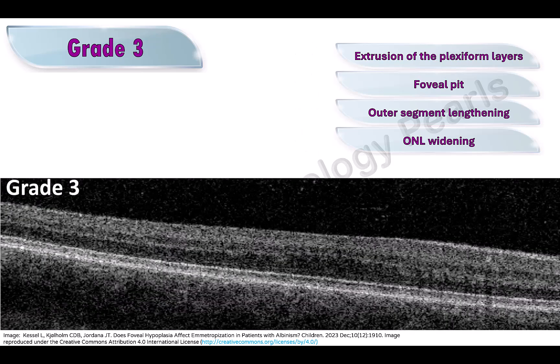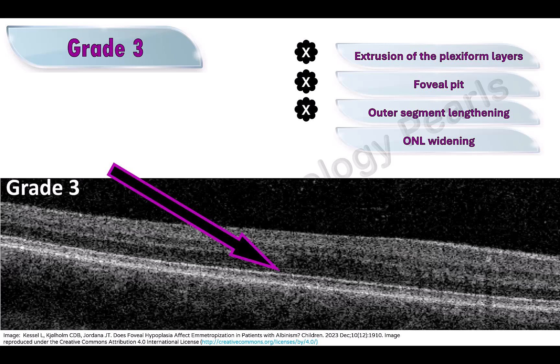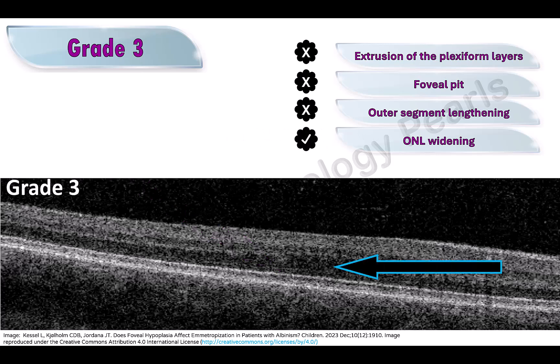In grade 3 foveal hypoplasia, extrusion of the plexiform layers and the foveal pit are absent. The outer segment lengthening is also absent — you can see that the elevation here has straightened out — but the outer nuclear layer widening is still present.